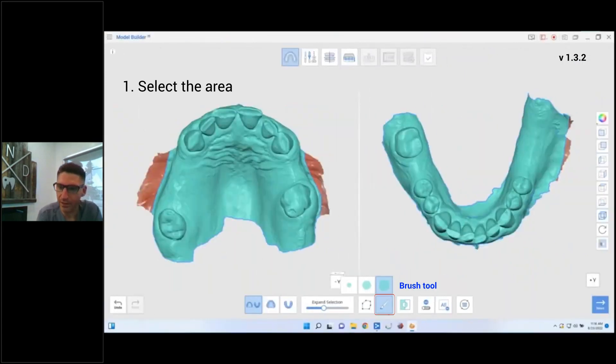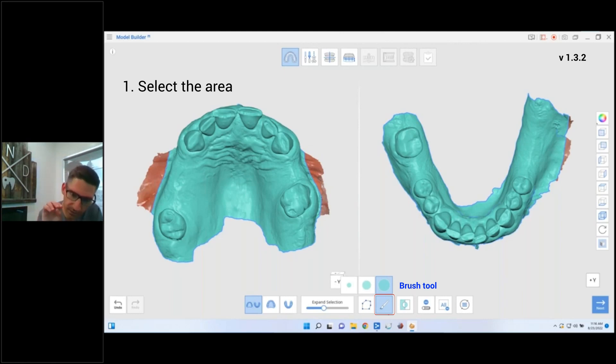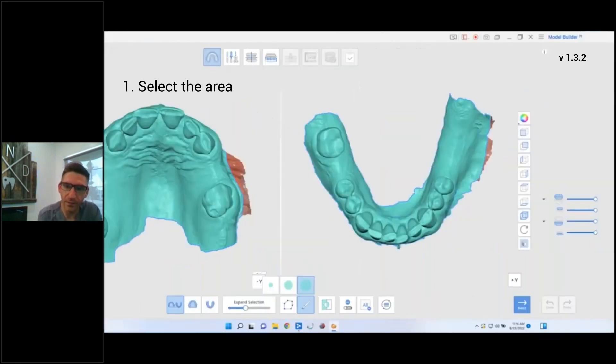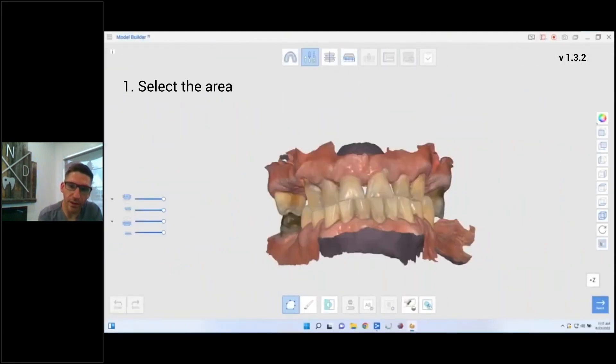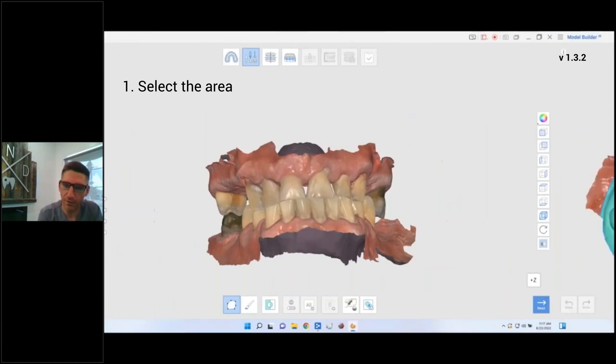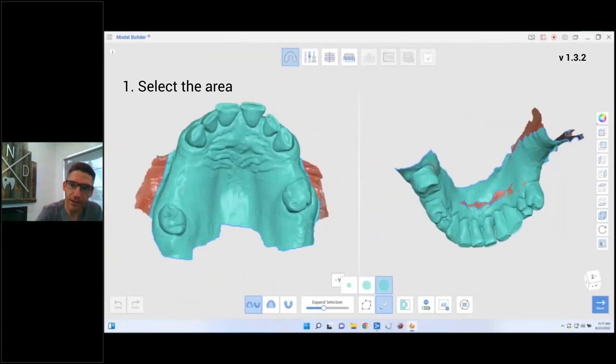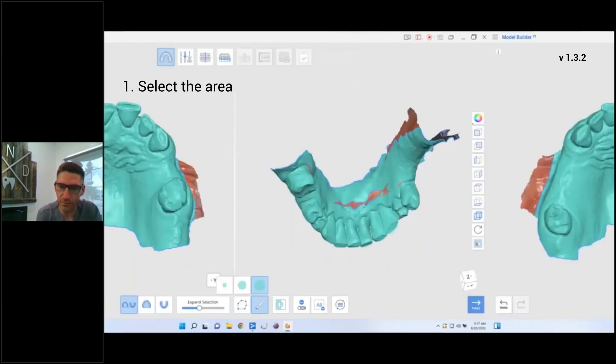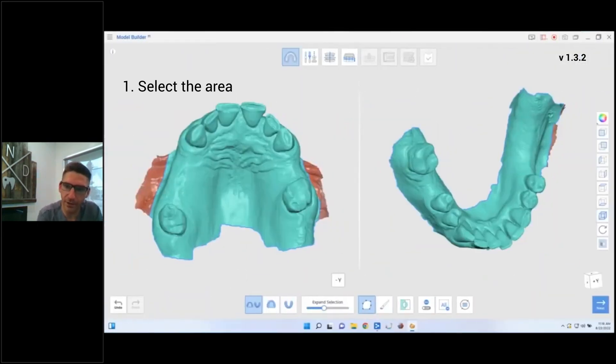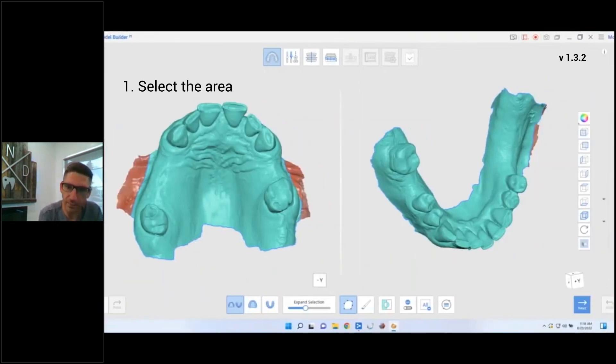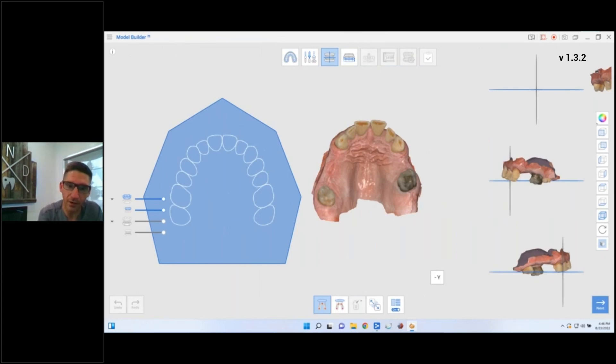Kind of drag around, select everything at once. You can use the brush tool, but I'm going to show you where the issue comes with that. If you're using the brush tool, the brush tool does not go through the 3D scan, it only covers the areas that you can see. So if you see here I lost my whole anterior flange because I drew on it from top view and it was not selected. And if you see here, the whole lingual, anywhere there was undercut, it was not selected. So you can use the brush tool, but just heads up. I went back over it with the line select and it picks up everything all the way through the model.